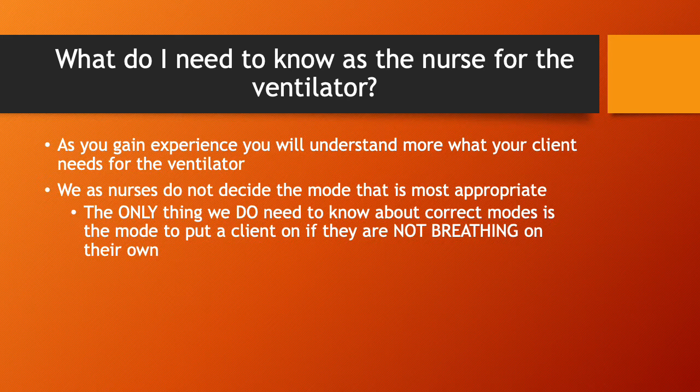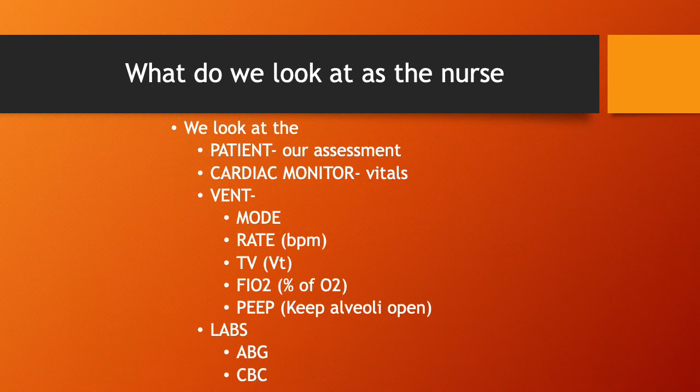So think about those emergency situations, that kill factor again. What mode is going to help a patient if they're not breathing? Because we definitely don't want a patient not breathing, not really knowing what mode to put them on. So again, we're really thinking more of those life or death situations or those critical situations. So let's go more into what we look at as the nurse.